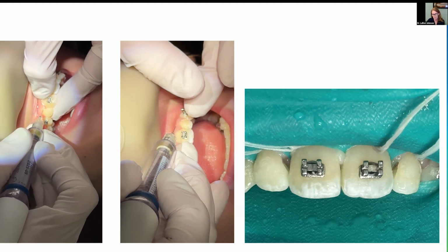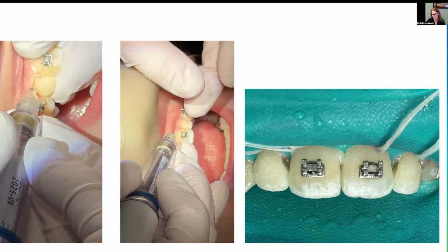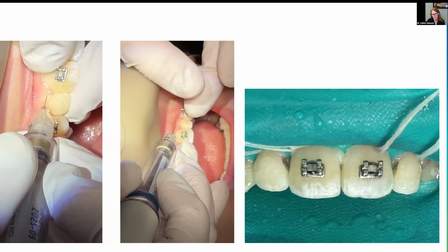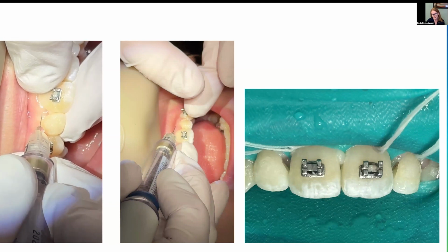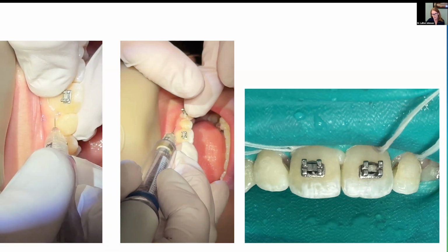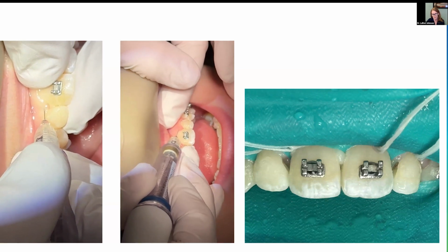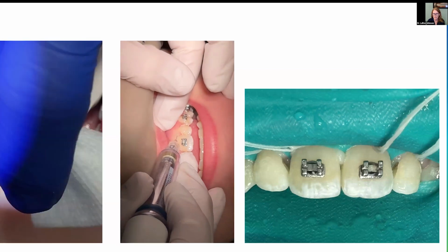And these kids do really, really well. And you can see I have a firm grip on our very anxious kid. Delivering that blanching stuff, that's exactly what that looks like. And then once you do that, and all of us pediatric dentists absolutely over blanch because we're so paranoid we're going to hurt one of our little friends. When we get it really well, I'm going to go ahead and start this one so you can see it at the same time. Then you come out, I like to dab it with a little 2x2.